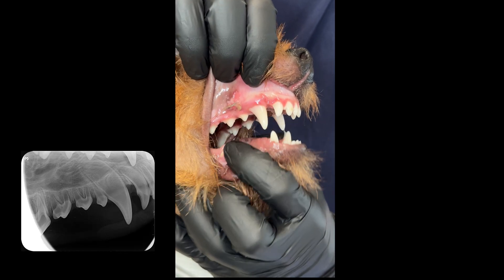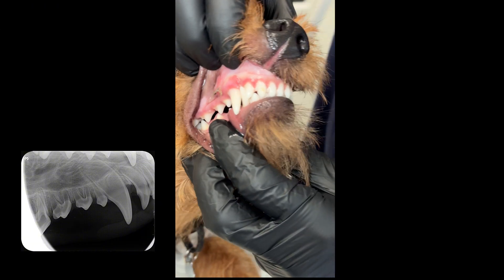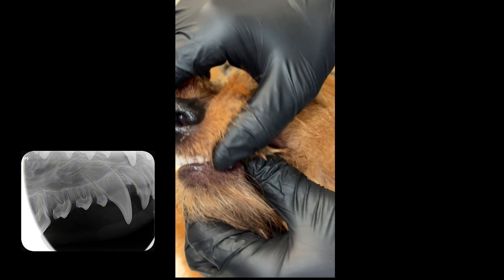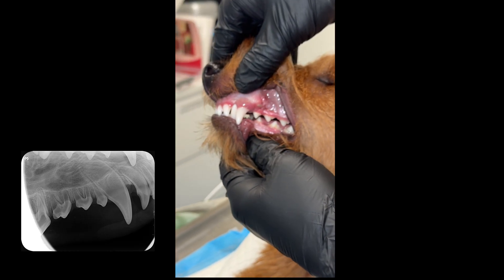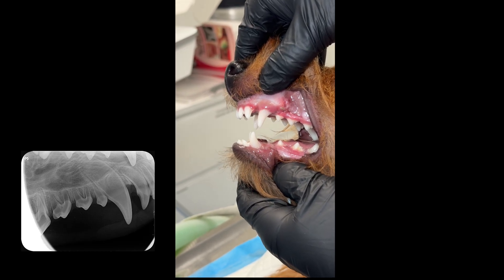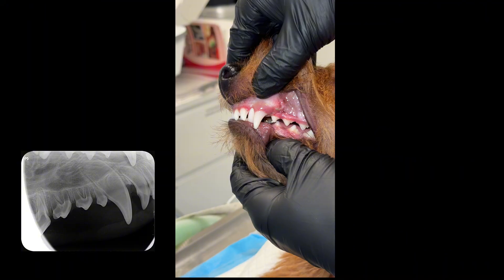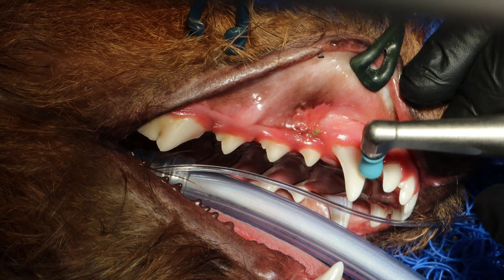You can see that it's making a tiny hole up into the gum area between 103 and 104. The diastema between 103 and 104 is not wide enough, so in order to fix that we can pull 104 back a little bit. It's important to always take X-rays before you start to make sure that the teeth are not malformed in any way.